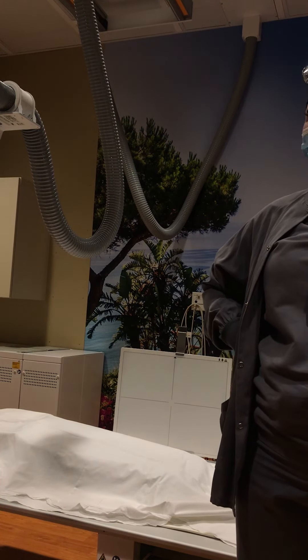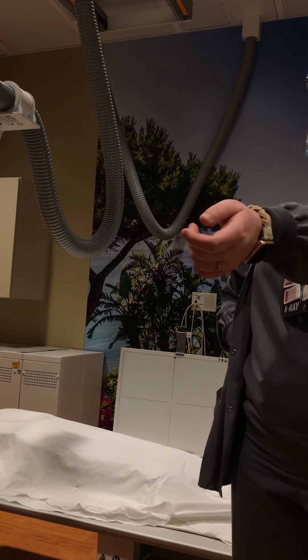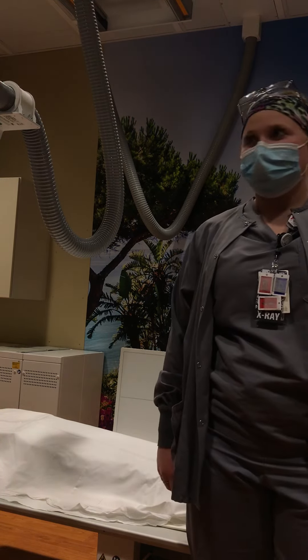Gina, my name is Jessica. I'm going to be the tech today taking your images. Before we get started, can I see your wristband and can you tell me your last name and date of birth? Darian Jarafori, 2000. And I just ask — any chance of pregnancy? Nope. And are you diabetic at all? Yep.